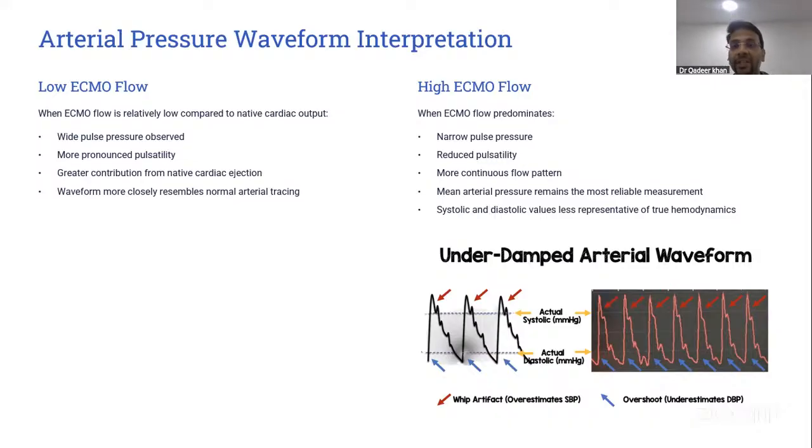But when the patient is on higher ECMO flows, not exactly a problem, but that's when you need to be careful about how you manage the patient, maintaining the circulation, how to avoid pulmonary edema, and how to unload the LV. When you are giving a higher afterload from a femoral artery higher up, LV function is impaired because of the high afterload.